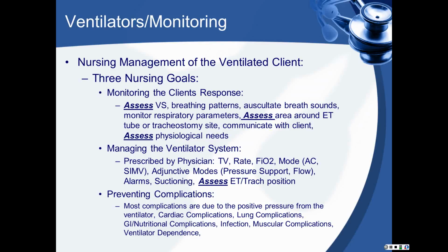Also, to prevent bacterial contamination, do not allow moisture to set up and water to set up in the ventilator tubing that enters into the humidifier.